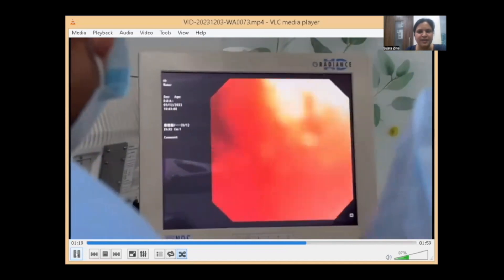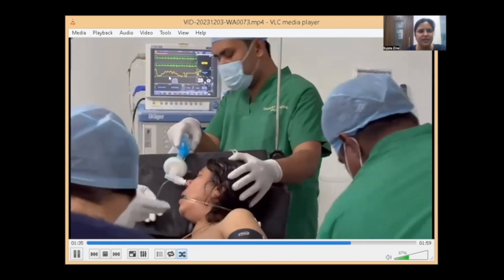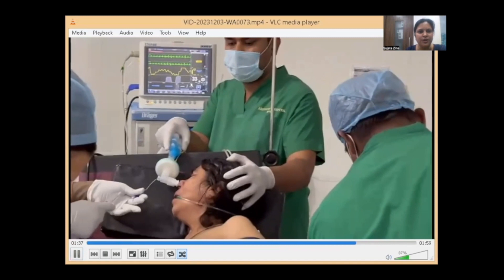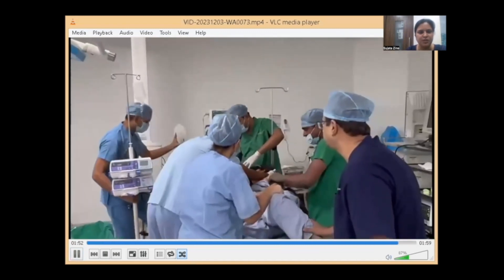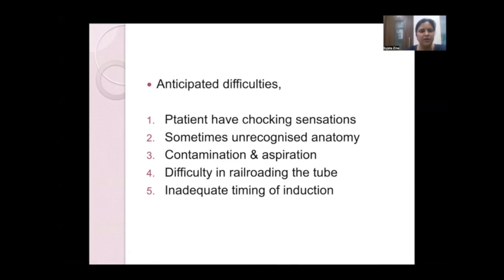The surgeon confirmed: as long as ventilation is achieved, there is no problem. ETCO2 was visible on the monitor confirming ventilation. A small liquid dose of propofol was given and the patient was made supine. The video was kept unedited to demonstrate the OT team dynamics. It was anticipated that at the narrowest lumen point, passing the fiber optic bronchoscope could cause complete choking or block of the airway passage.